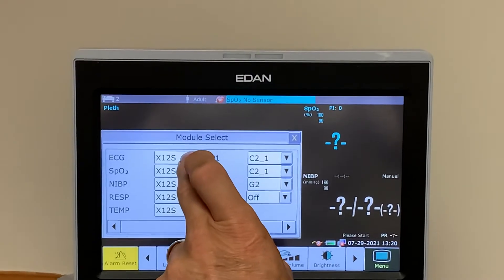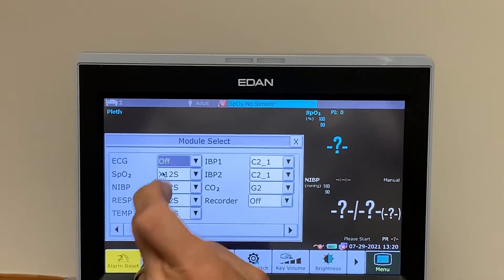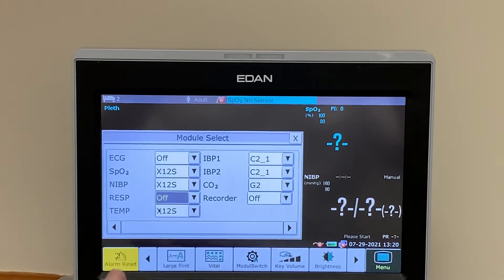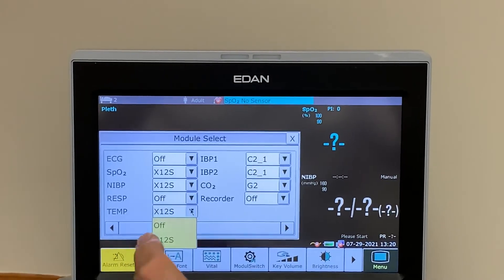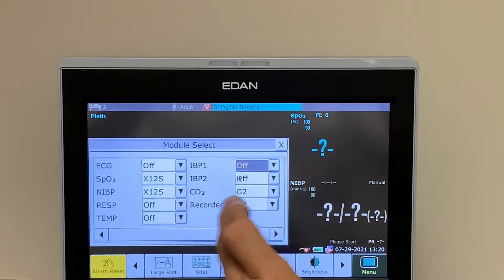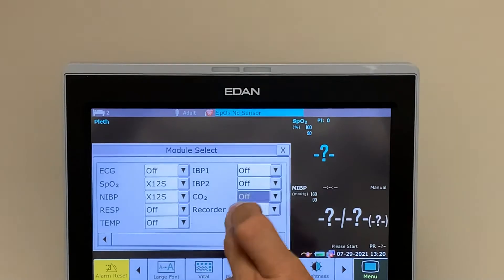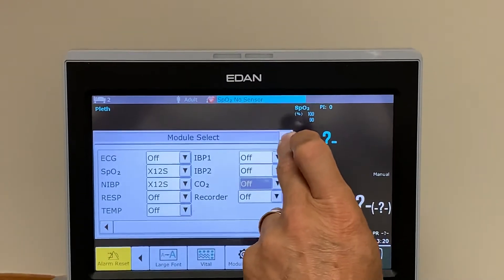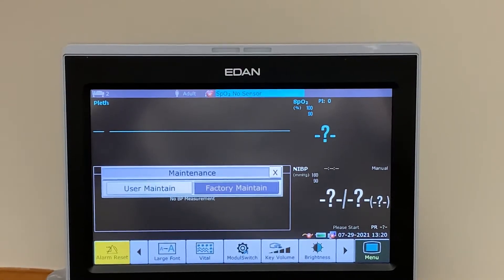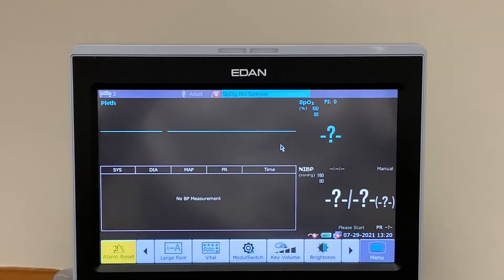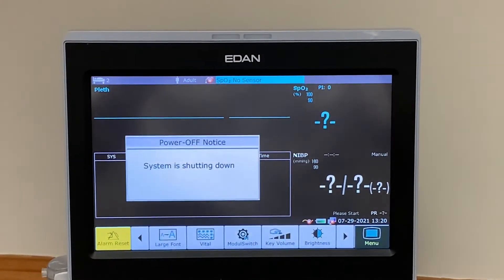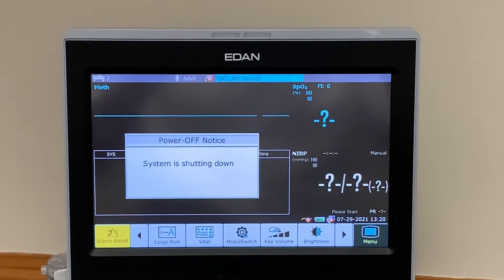Starting with ECG, we turn it off. Go to Respiration and turn it off. Temperature, turn it off. IBP, turn it off. And CO2, turn it off. Remove all the menus. We now need to turn the machine off, because the act of turning it back on again recognizes the changes we made in the factory configuration.